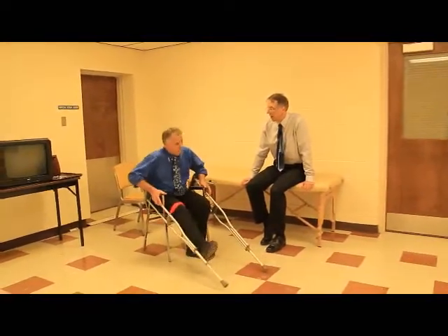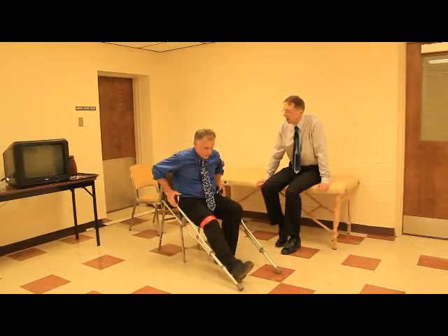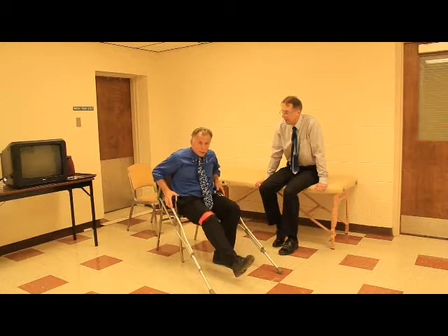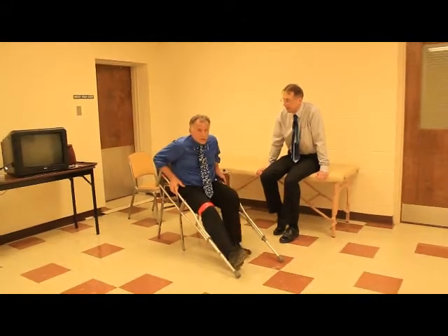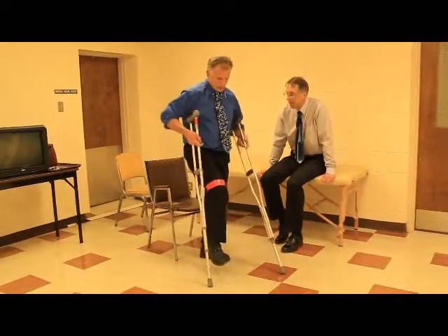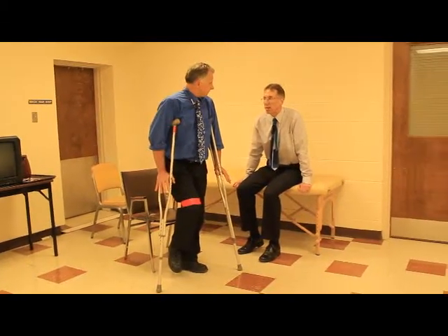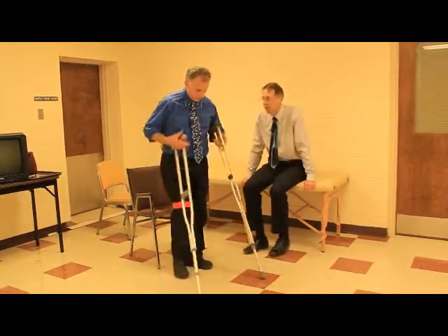Back here — you move all the way to the edge of the chair without falling off, and then you're going to really lean forward a lot more than you think you would. This red tape means that's the leg I cannot bear weight on, so I keep it out in front of me. Pull this foot underneath, lean forward, push up, and keep that leg off the ground. People are always leaning more forward than they think — you've got to lean forward. People are afraid they're going to fall forward.